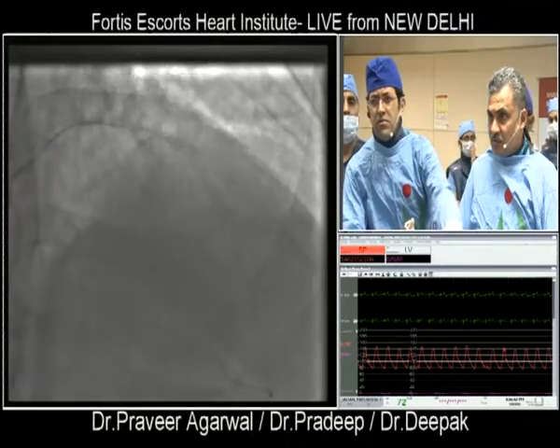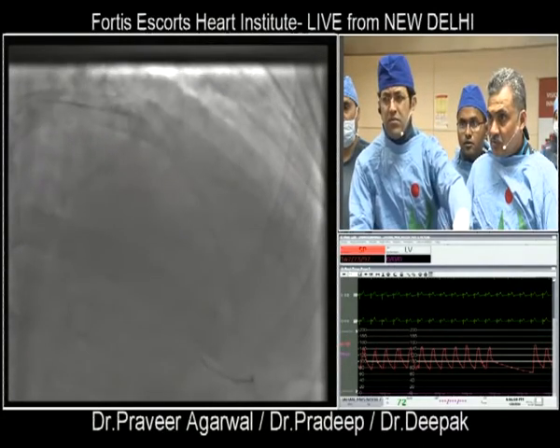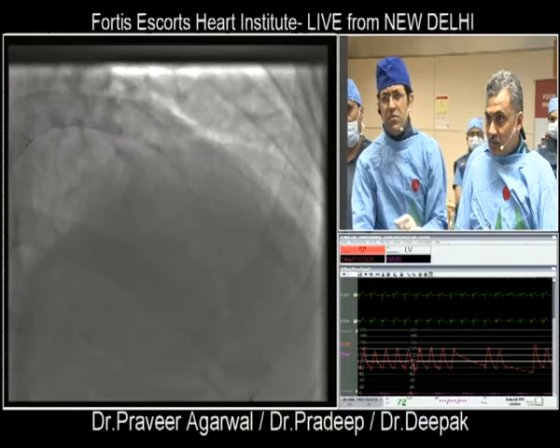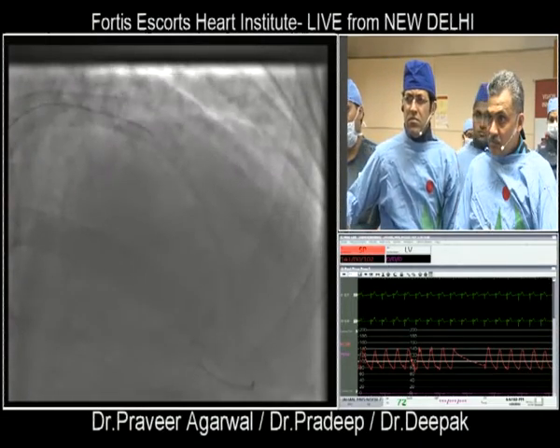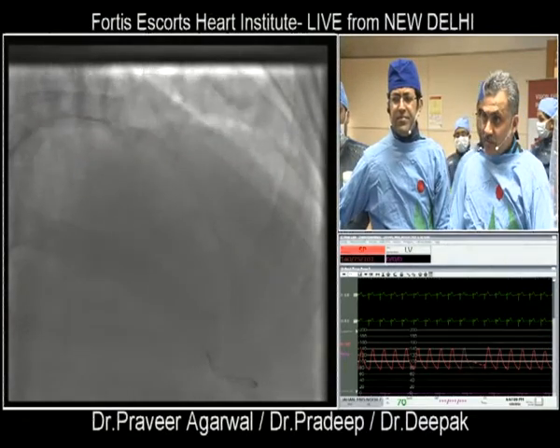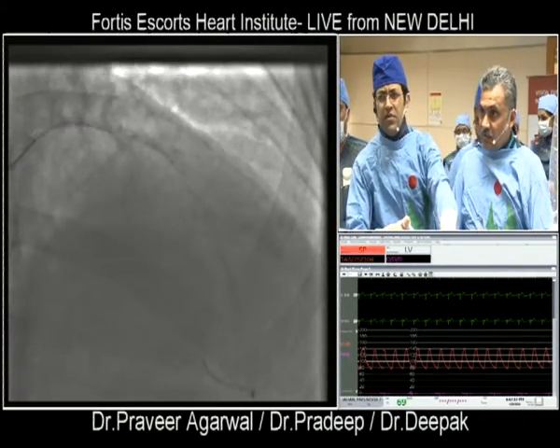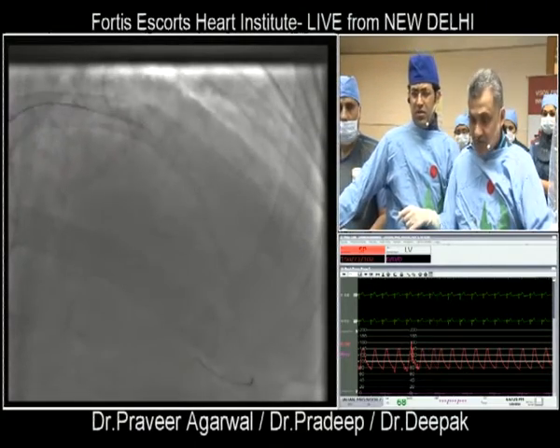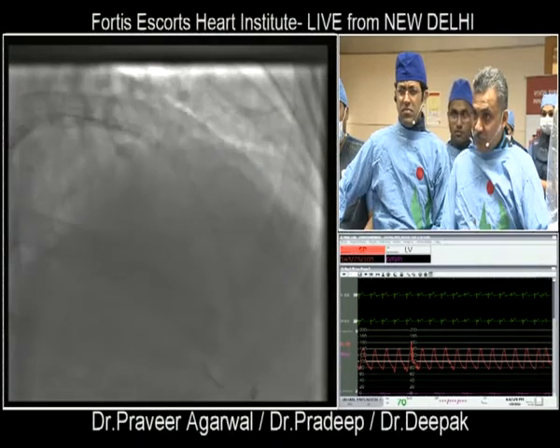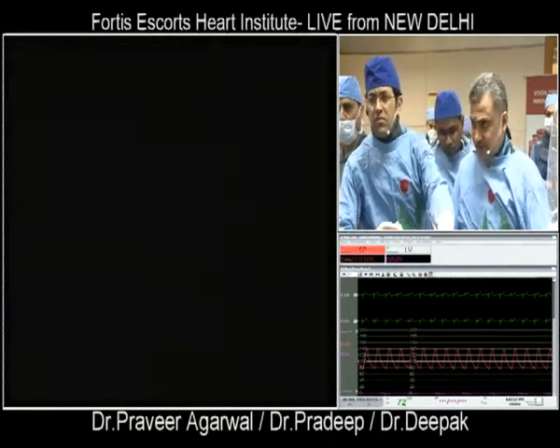Small. Just a moment. Check, please. Can you whisper please back again? Okay, this is not taking the... You see, still there's not enough room for it to rotate. I think I have to dilate it a bit more and take a chance, because it's just the same as it was before. Check. I'm just taking another shot.